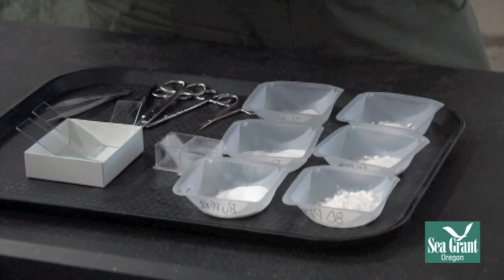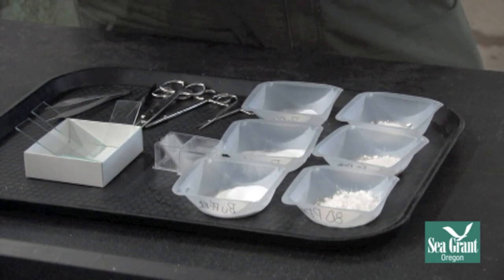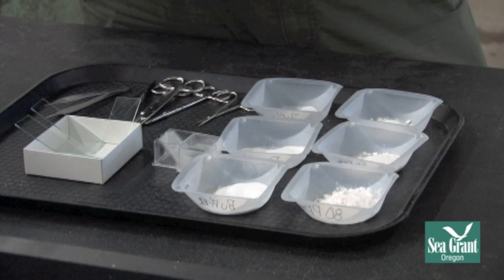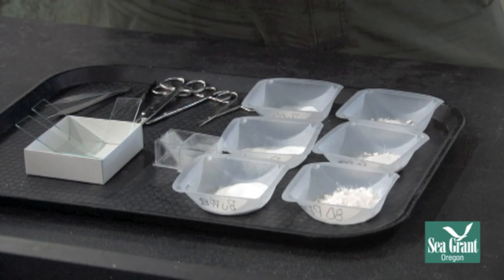Once we have it all weighed out, we add this directly to the water that the fish will be in. If we're using a fish tank, we pull the fish out and have it in a separate tote or bucket for sedating. We add the drug directly to that because you don't want to add the drug to your whole fish tank or pond where you might risk sedating everything else.